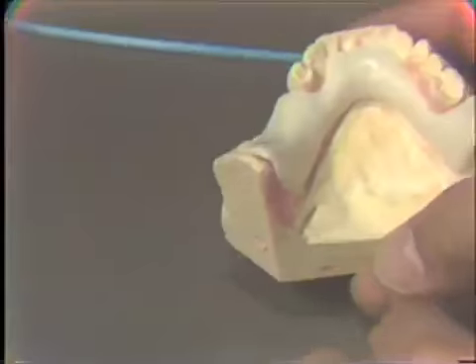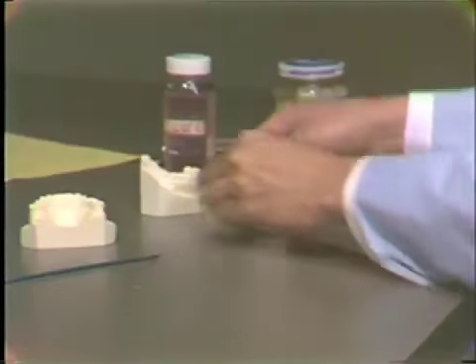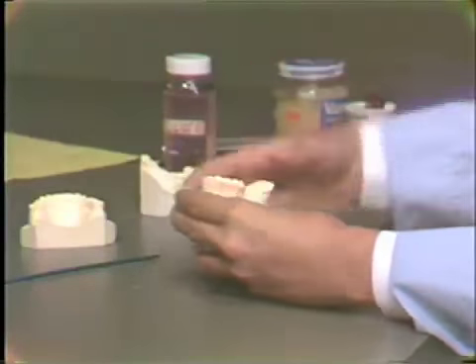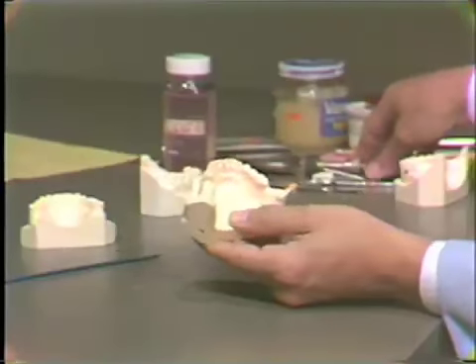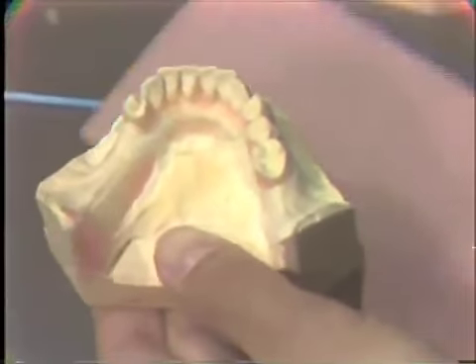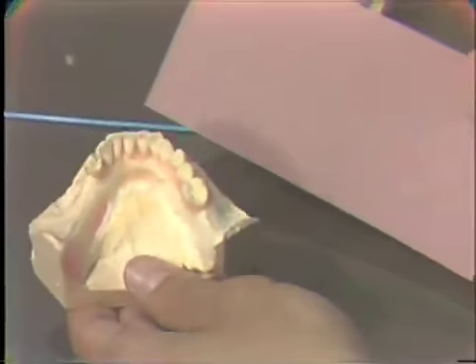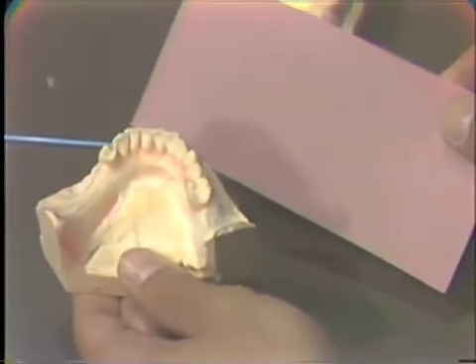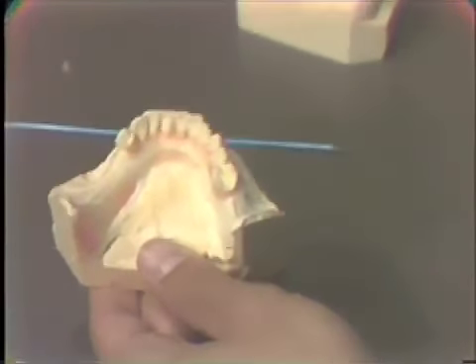Now, in the fabrication, the first thing that we would do would be to block out any undercuts on the cast with a pink baseplate wax. This is the denture or baseplate wax. This wax cleans up very nicely from the cast and leaves very little residue when it is cleaned off properly.